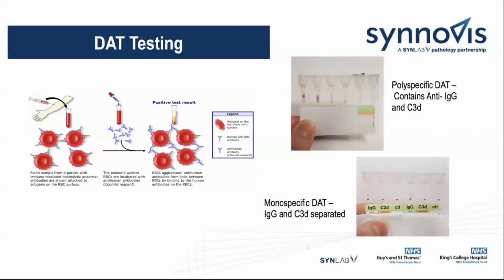At the reference centre, they have a lot more ability and capability to test for other markers on the red cell. So if the DAT is positive, an eluate is made from the patient's red cell, and this should be prepared and tested for the presence of specific alloantibodies. And it's not unusual for the antibody to be in the eluate, so bound to the red cell, and absent in the plasma due to the concentration being low.